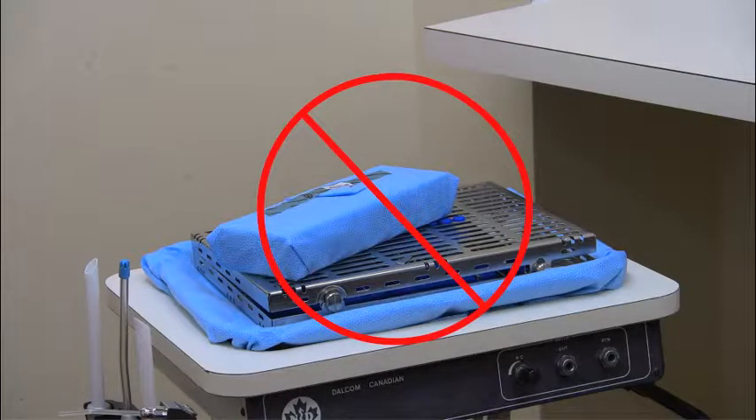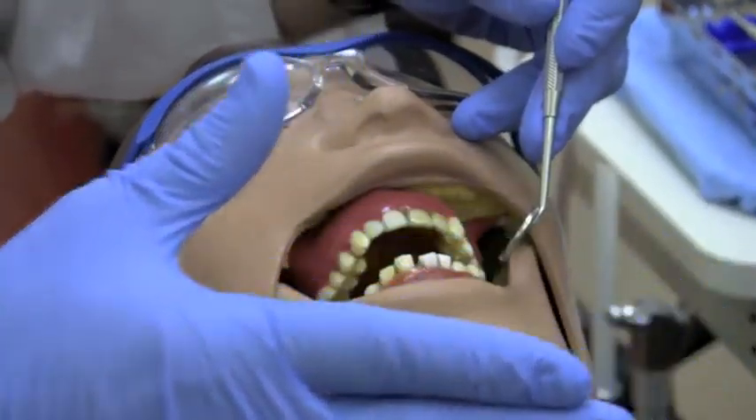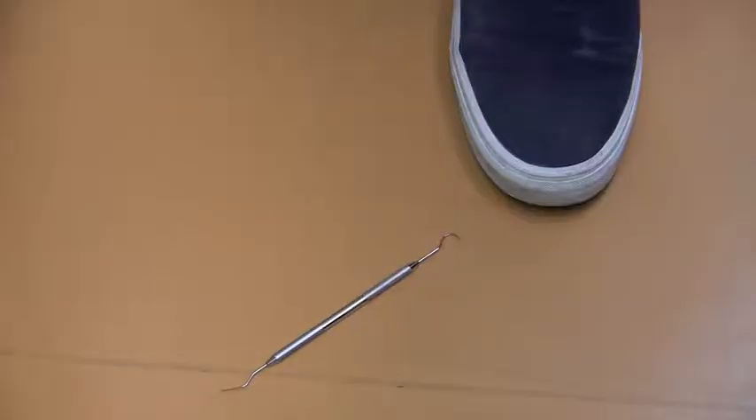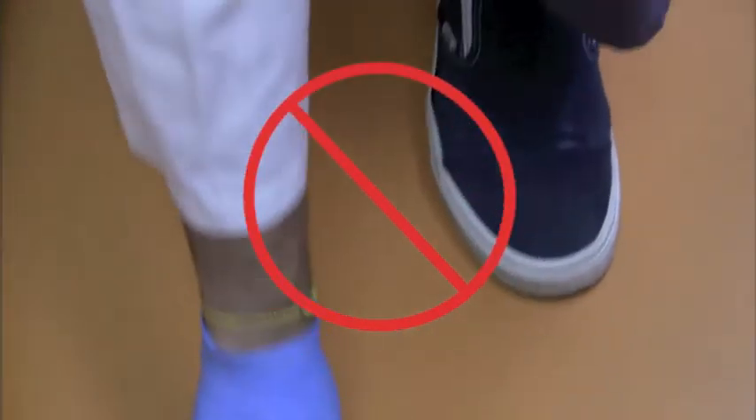Do not cross-contaminate wrapped and clean instrument trays with used trays. Place clean trays away from the operator and assistant carts. When an instrument drops on the floor, do not pick it up and reuse it. Get a new instrument from a clean kit and pick up the contaminated instrument at the end of the appointment.